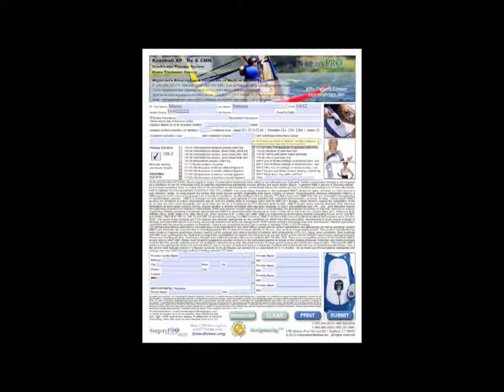Now, I need to indicate the treatment sessions. Usually it would be 3 sessions per day at 20 minutes, or 30 minutes, 25 minutes. Your call. You can also put in something here to say, 3 by 20 minute standard, or as directed by PT. You could just list your normal treatment approach here. Any additional instructions we need to know, you would enter there. You have this much space, so not a ton, but hopefully enough.